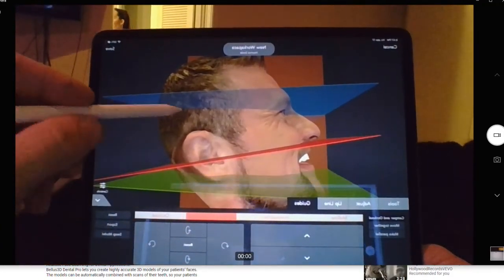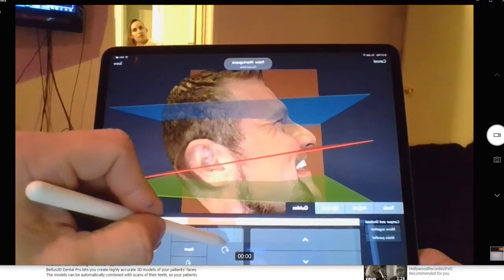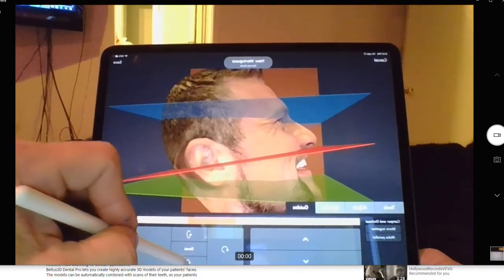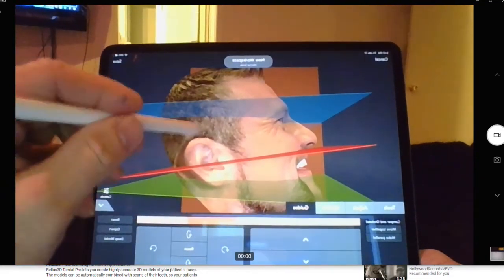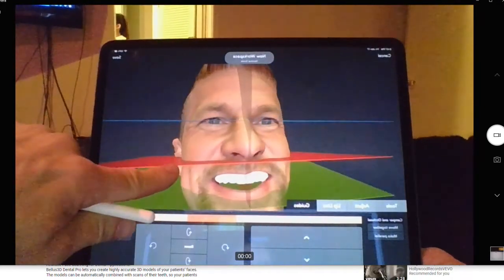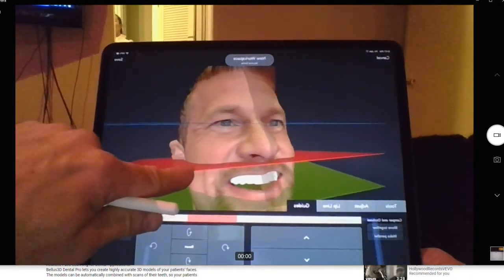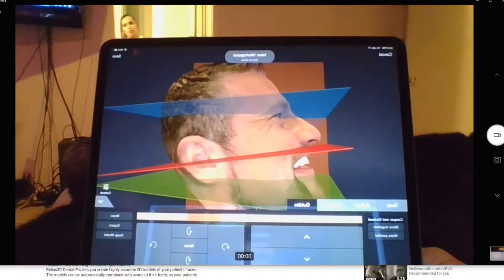Make a drink. Okay, that looks, I want to be in the center of that little guy right there. Okay, and then, so that's a good ala tragus. I'm going to look at it from the front just to be sure. I like it.